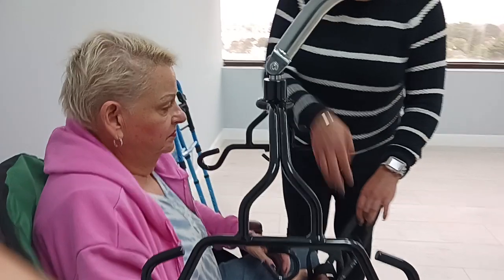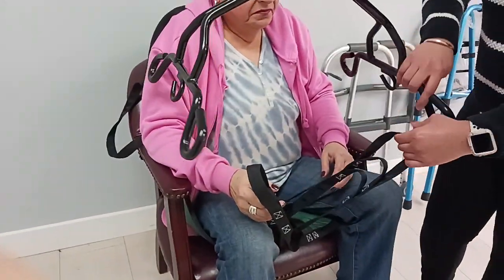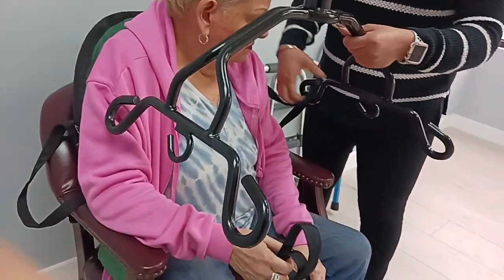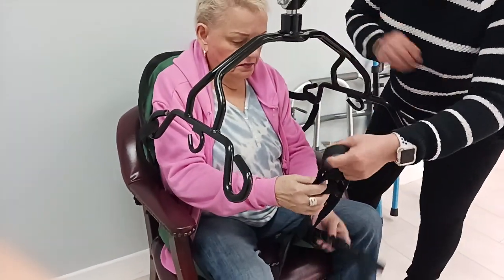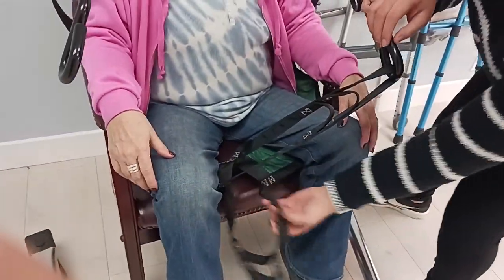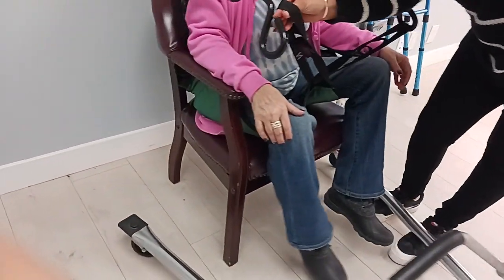So depending on the patient and how big they are, we go off of these notches. Okay, so you can go first — we have these. Make sure they're crossed, and put these in. Those have to be crossed? Mm-hmm, yes, they have to be crossed. That's what's underneath your leg like a swing.